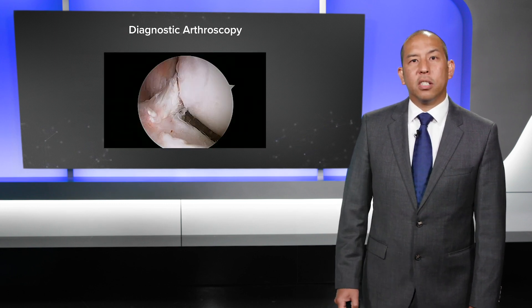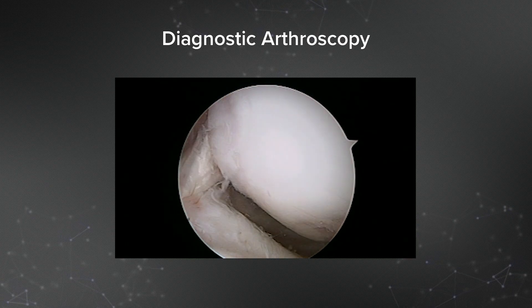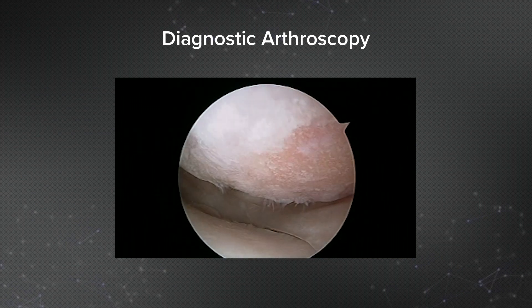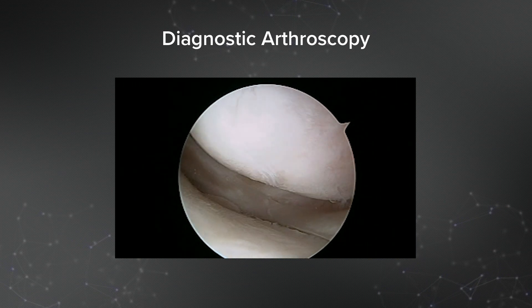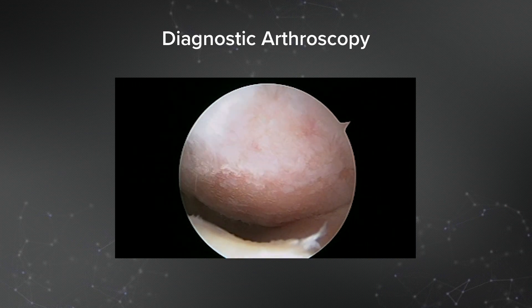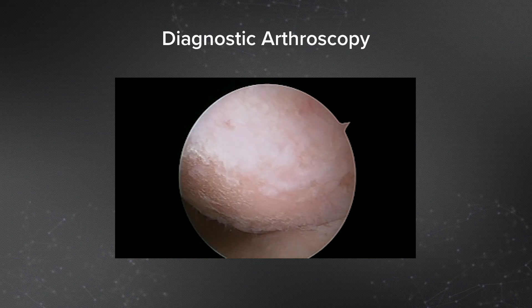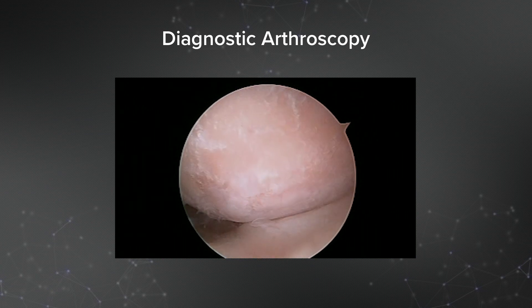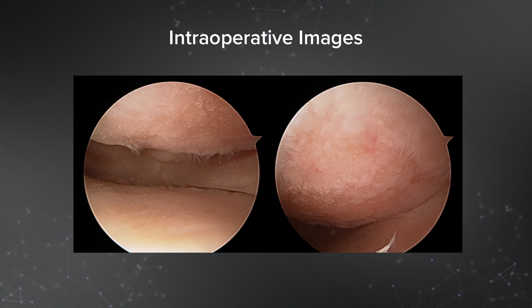Here's the diagnostic arthroscopy at surgery. You can see she has an intact ACL. Sweeping into the lateral compartment, you can see a very broad lateral condyle lesion — grade 4, exposed bone. She has some cartilage medially on that condyle, but laterally this is a bad and difficult lesion in a 28-year-old active patient. She does not have a kissing lesion on the tibia, which makes her a good surgical candidate, nor does she have any meniscus tear. Additional intraoperative images confirm that broad grade 4 lesion with well-preserved tibial cartilage.